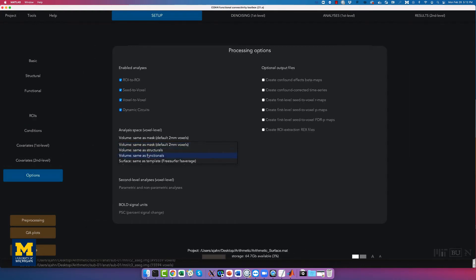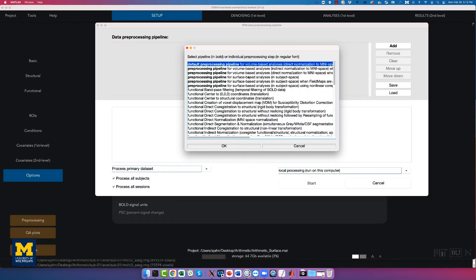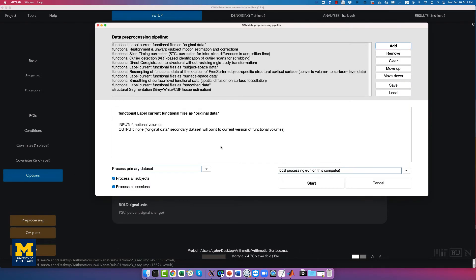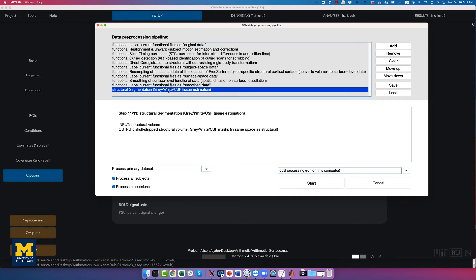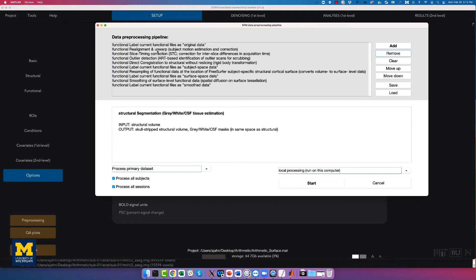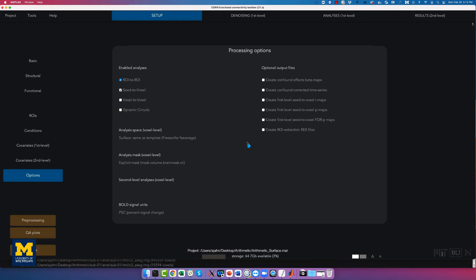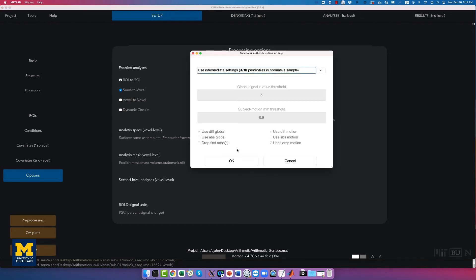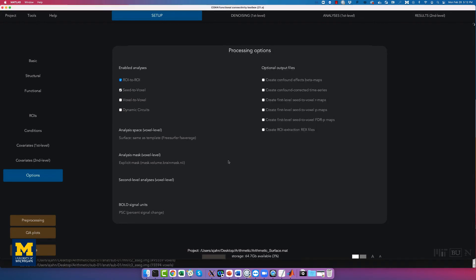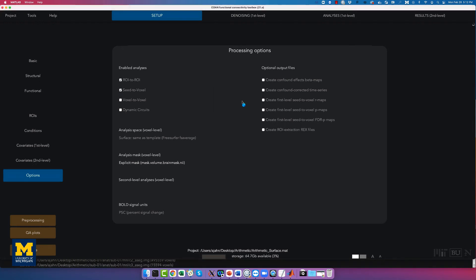Click on options and change the analysis base to 'surface same as template'. Uncheck dynamic circuits and voxel-to-voxel to save time. In pre-processing, select the default surface-based analysis pipeline. Remove the segmentation step since we already imported the segmentations from FreeSurfer, and also remove slice time correction because the slice timing order is uncertain. Click start and select the defaults when prompted.